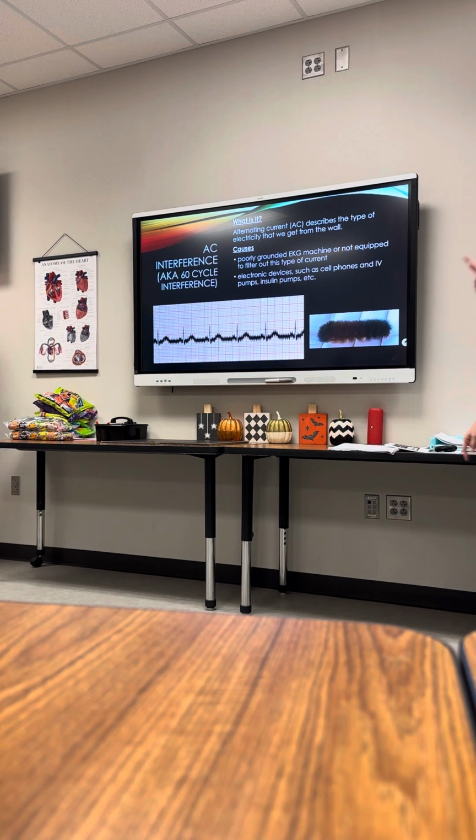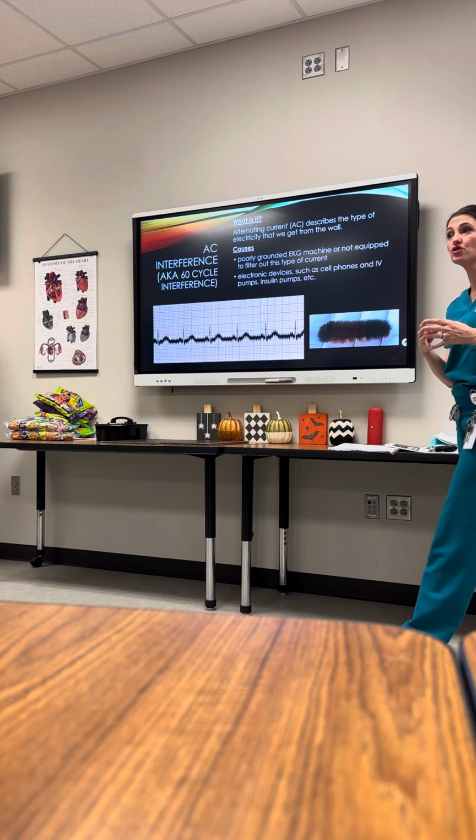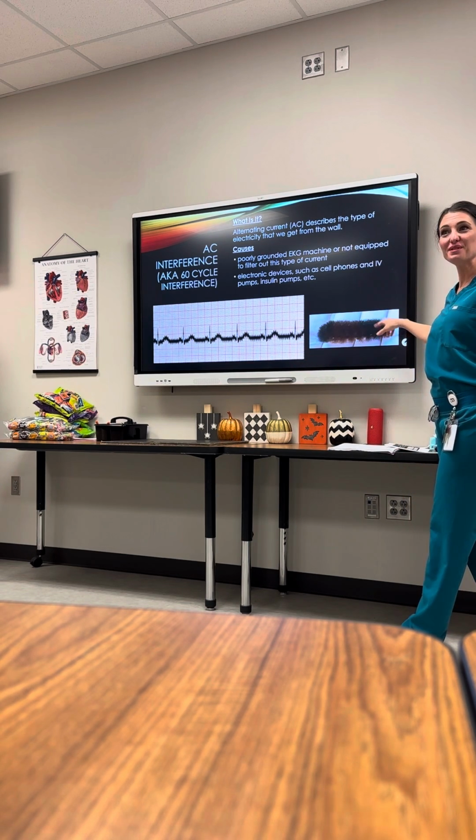Electronic devices such as cell phones, IV pumps, insulin pumps, all kinds of machines in the hospital, right? Those things could also be contributing to this type of artifact. This little fuzzy caterpillar is just kind of a visual to help you remember.